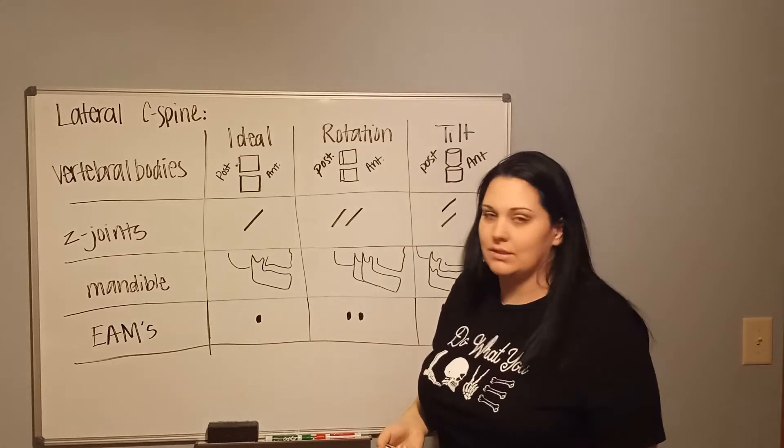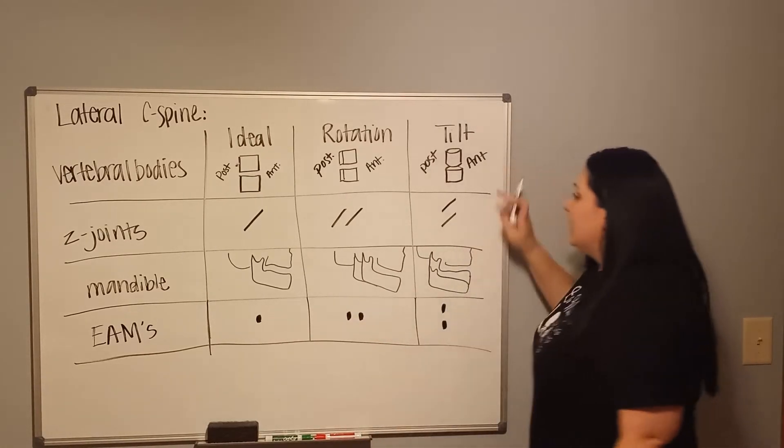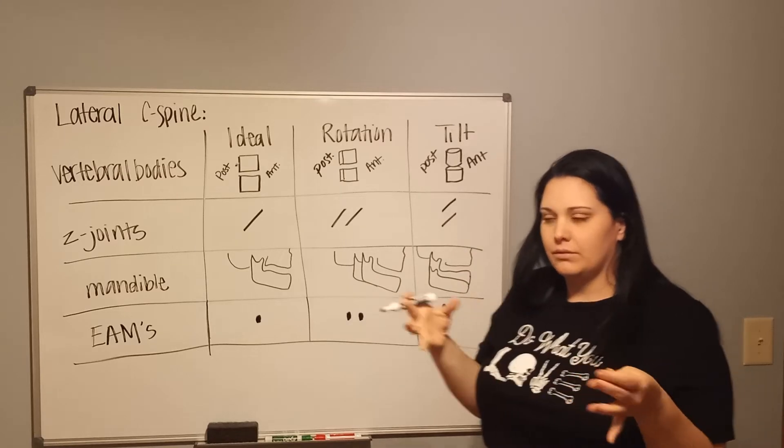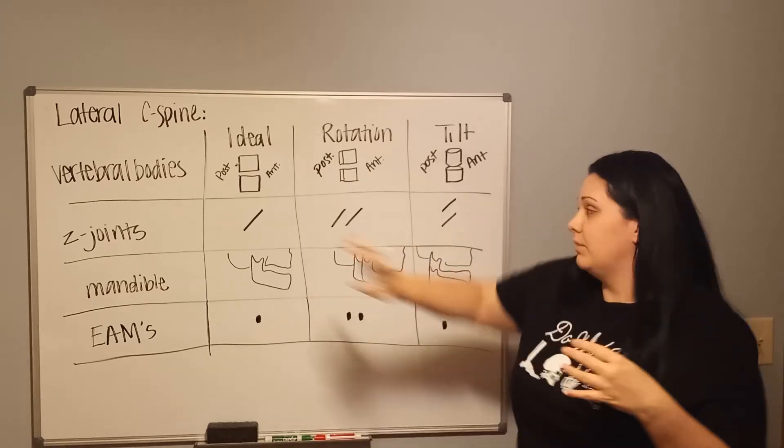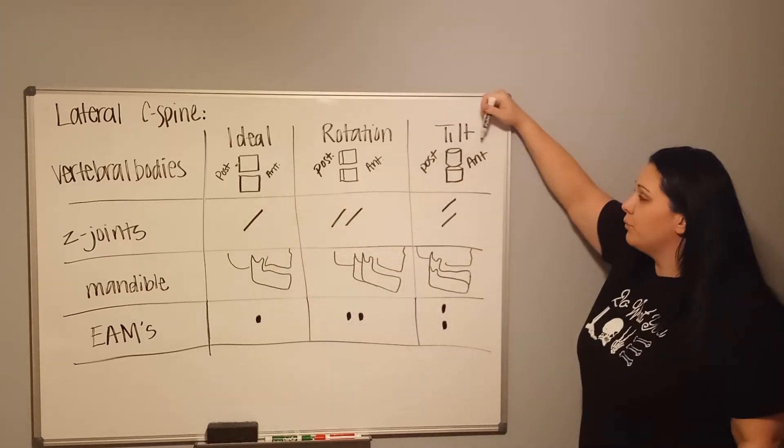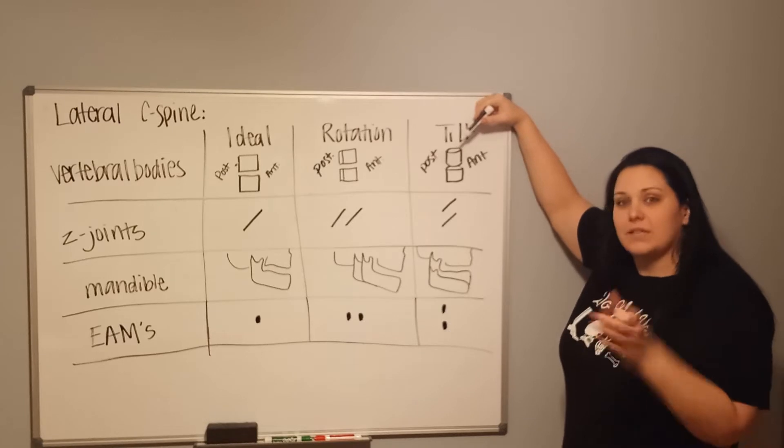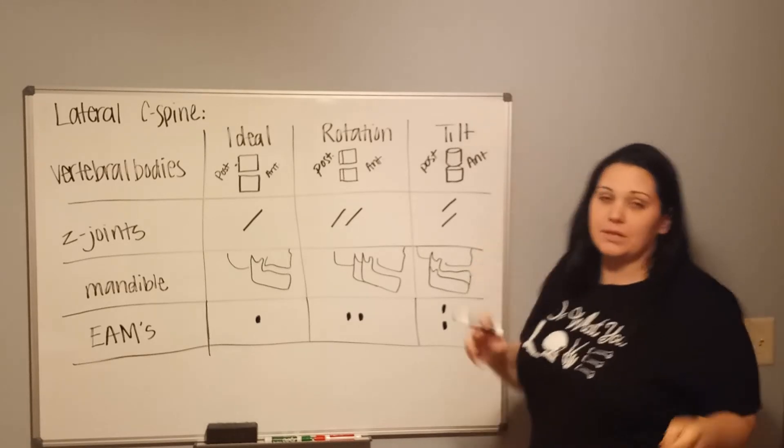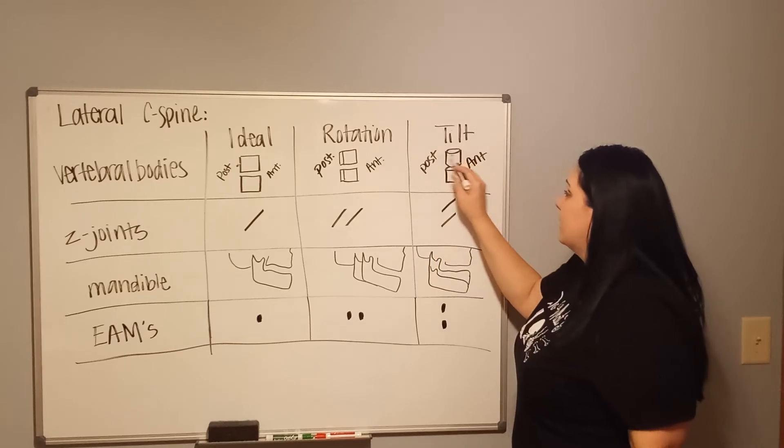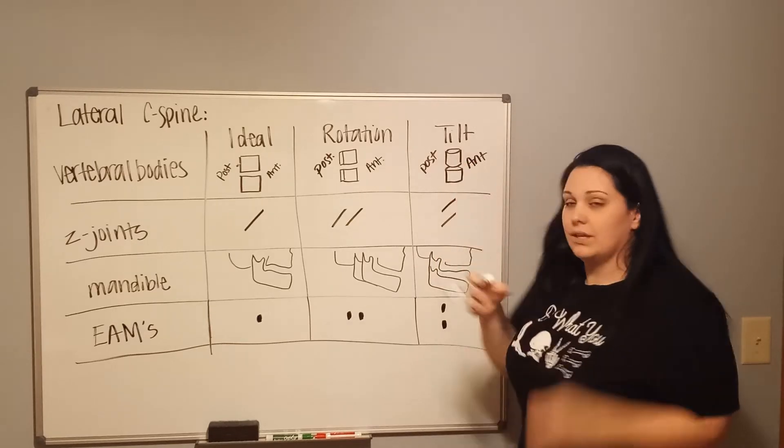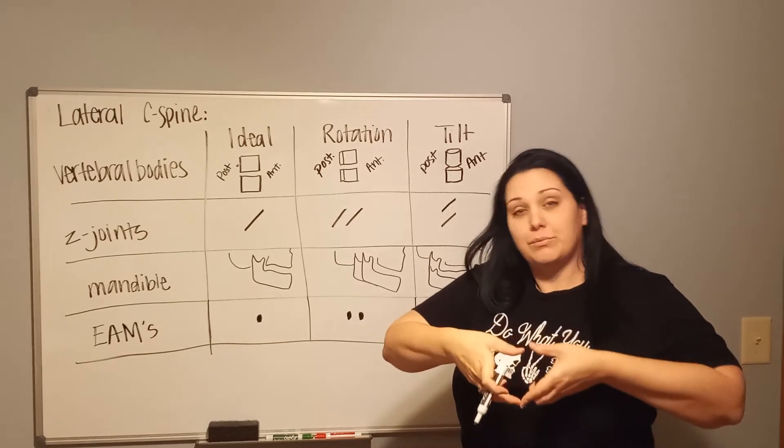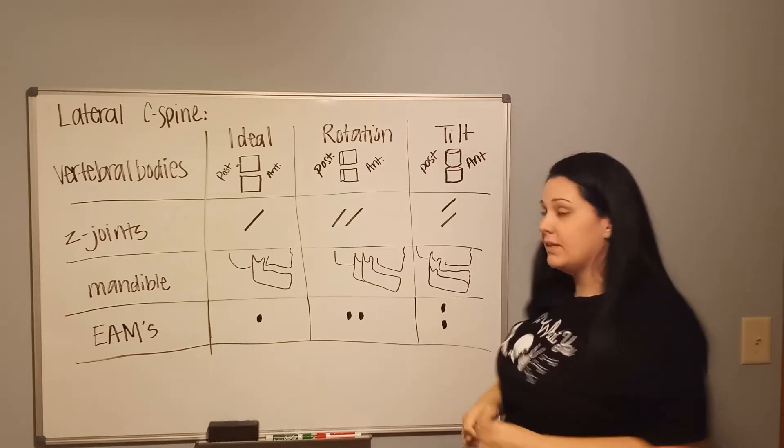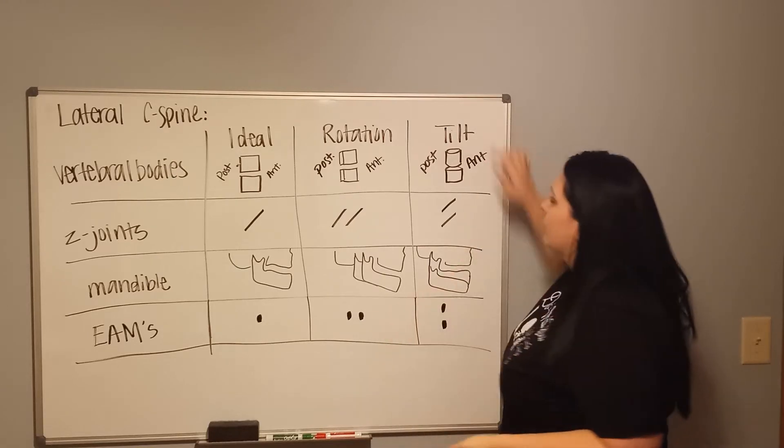Vertebral bodies for rotation will show up like ice cubes. Tilt, on the other hand, is going to show superior-inferior displacement. With tilt, you're going to see the articulating surfaces of that superior or posterior portion of the vertebrae. I call tilt vertebrae how they look like marshmallows, because I can see that articulating surface and it looks, instead of flat, it has like an oval shape to it.